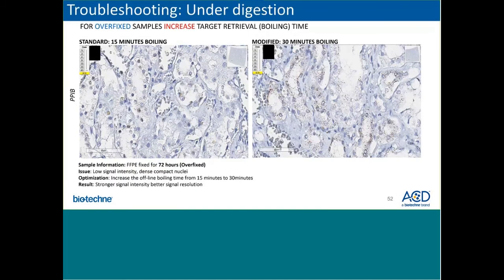Here's another sample of overfixed tissues in which we would need to increase the target retrieval boil time. So on the left-hand side, we'll have a 15-minute boiling time standard stained with PPIB. Again, these tissues were fixed for 72 hours, so way beyond our 16 to 32-hour window. To optimize this, we've then increased the boiling from 15 minutes to 30 minutes, in which you can now see much better signal intensity and signal resolution.